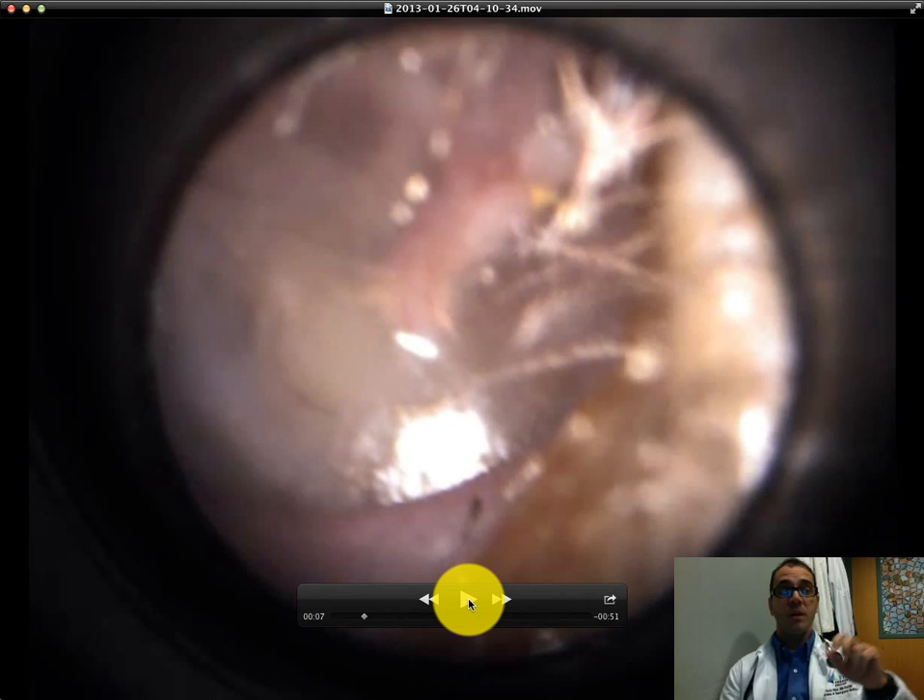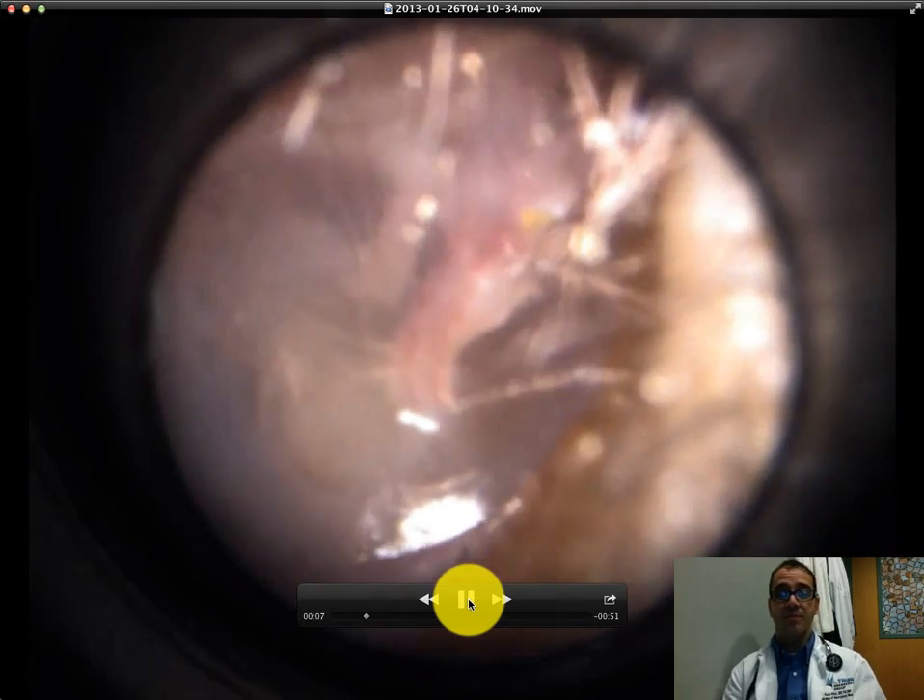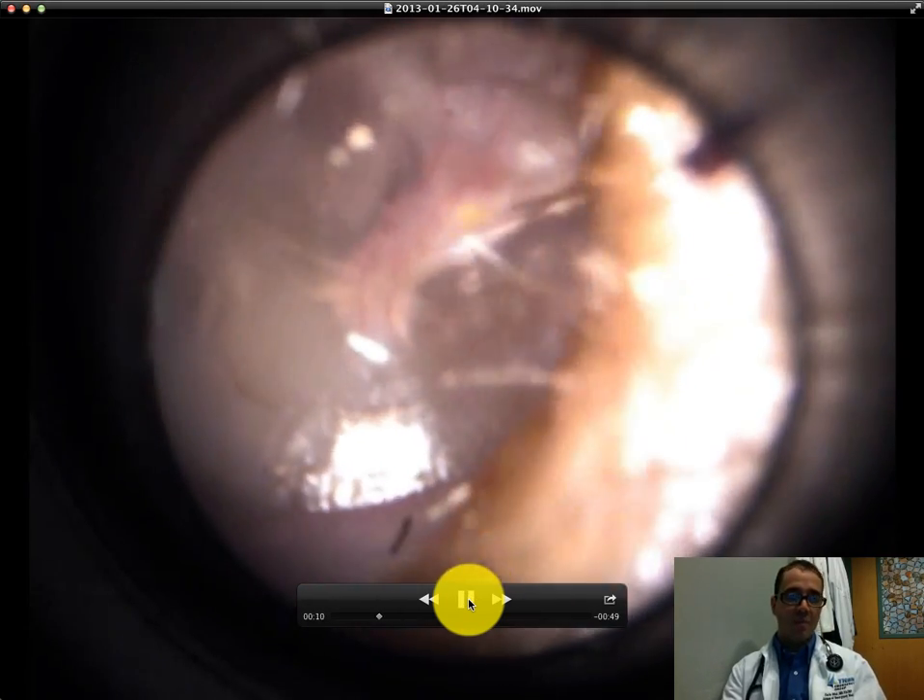Those people that are zealous about cleaning their ears are actually hurting the normal ciliary movements of those hair cells and affecting the overall health of that ear. But let's get in there and look at this tympanic membrane.